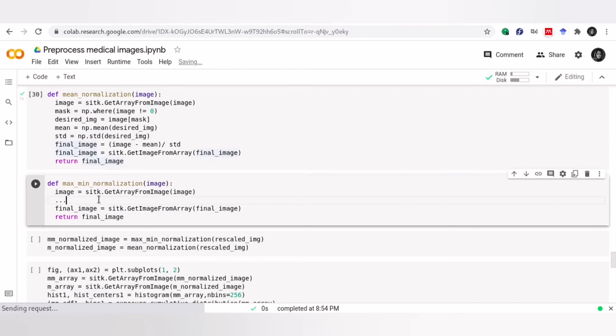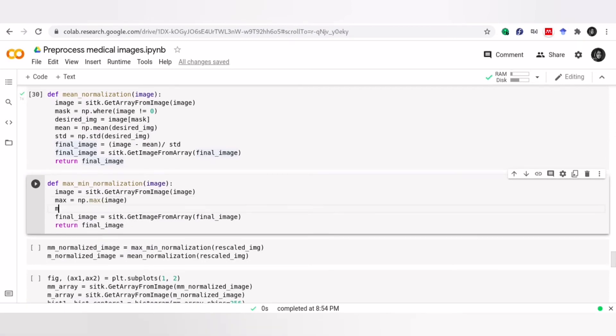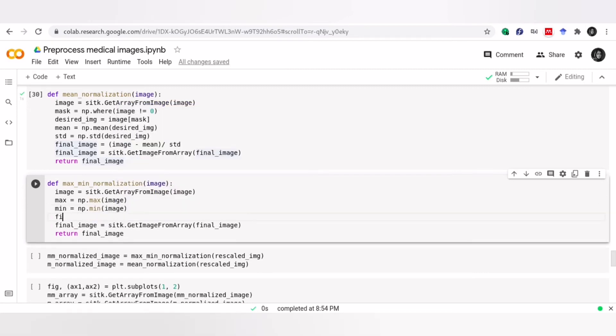In the second technique, we normalize the voxel values, so that each voxel has a value between 0 and 1. To do that, we need to calculate the minimum and the maximum value in each image, and use them for normalization.